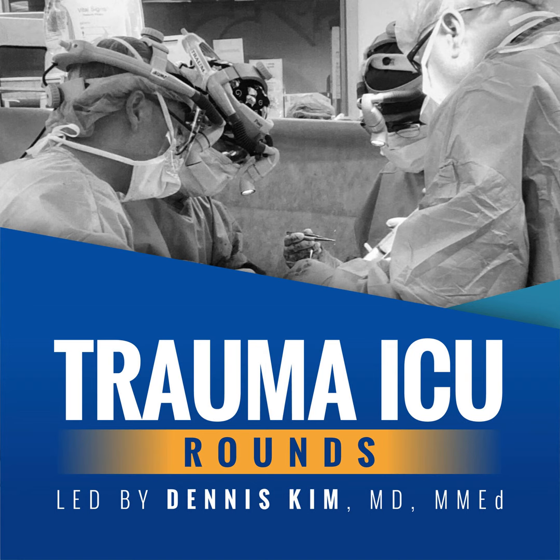One is the pressure needed to cause flow through the airways and overcome the resistance to airflow. That resistive pressure is the product of flow times resistance. The second pressure is the pressure required to overcome the elastic recoil of the lungs and chest wall. The required pressure to overcome the elastic recoil is the product of elastance and tidal volume or volume. Given that elastance is the inverse of compliance, this can also be stated as tidal volume over compliance.